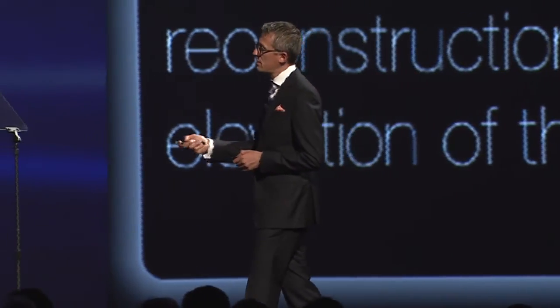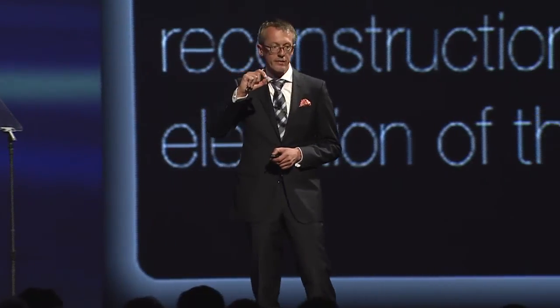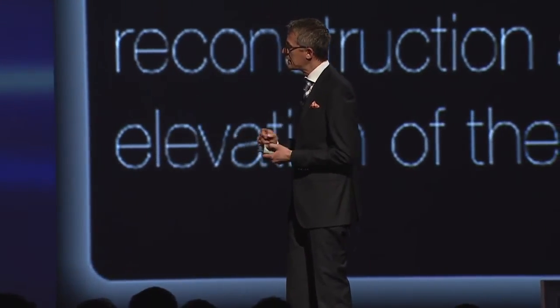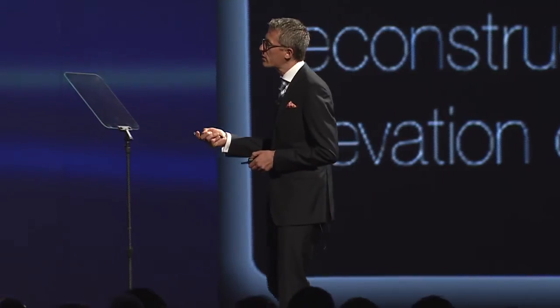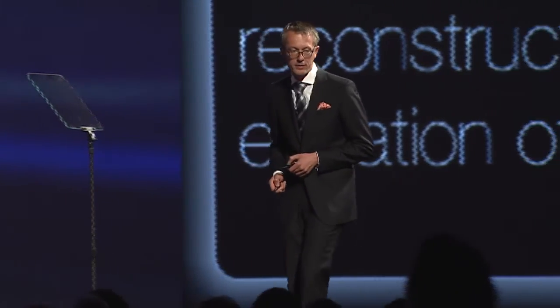What happened? We had severe erosions and abrasions. We had loss of vertical dimension because the patient was working very hard with his teeth, and he was quite young. He was 35. So we had to reconstruct the occlusal surfaces, and we had to elevate the bite.